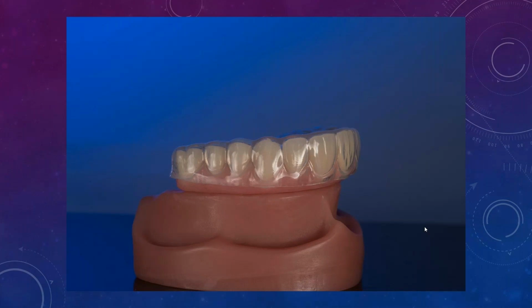Once I do that, oftentimes we'll adjust the occlusion chair side, make sure everything's good, and then we'll do a scan and create some kind of night guard. Now this is just a regular suck down night guard, which I don't often recommend, but some people still do them. A lot of people will just do a regular hard soft from Keystone or something like that, or they'll do a hard night guard just to protect occlusion while the patient is sleeping, to make sure things go well.